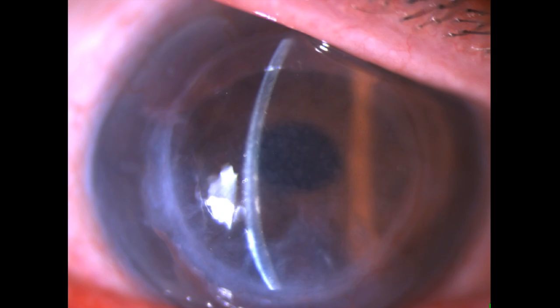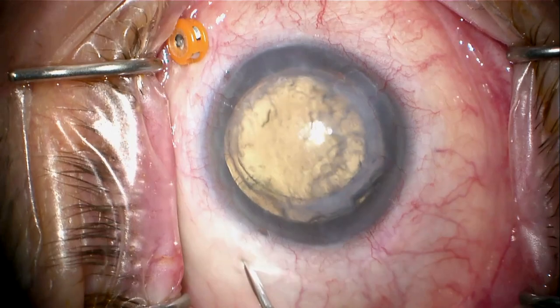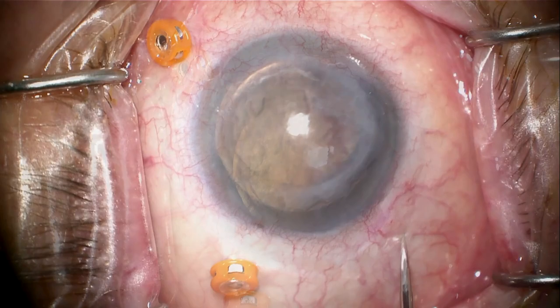This is a patient with a failed 50-year-old corneal graft and his only seeing eye. The lens-bag complex is dislocated onto the retina. We're going to take that out, do a YAMANI, and a penetrating keratoplasty all in one shot, as this is his only seeing eye and he comes from pretty far out of town.